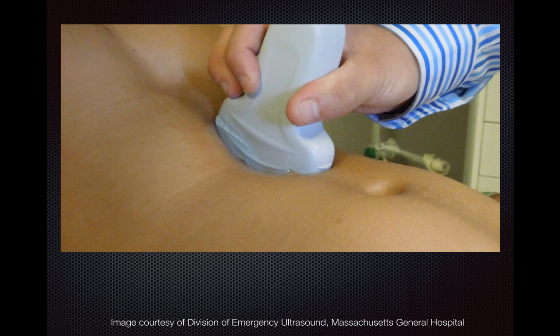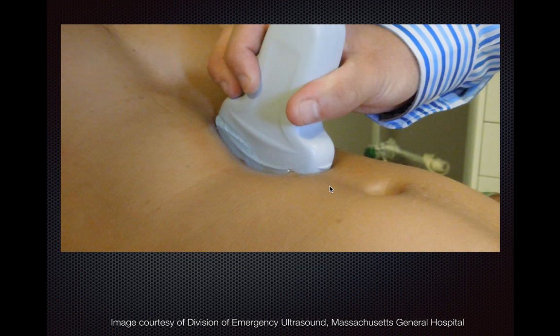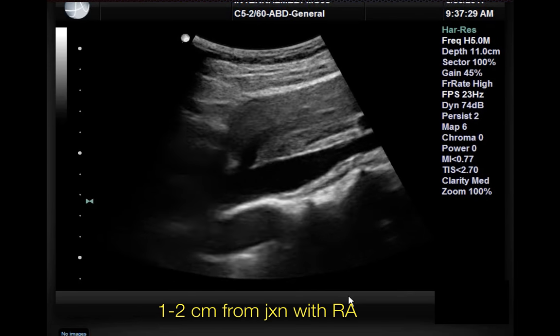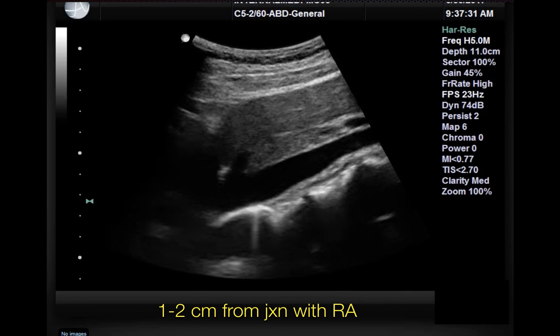It doesn't matter how you actually obtain the image as long as you get a decent image and are really getting the measurements that you need. My personal preference is to start with the longitudinal axis with the transducer marker towards the head. I typically put it a little to the patient's right, because the IVC is on the right side of the patient and the aorta is a little bit to the left. So I would start in this view and then slide a little bit towards the patient's right.